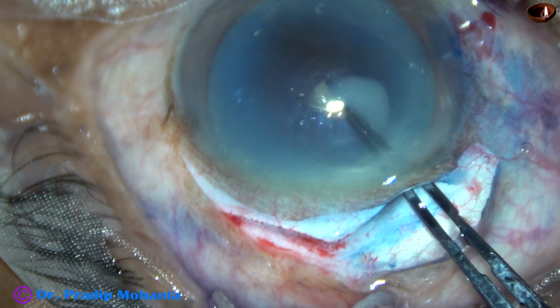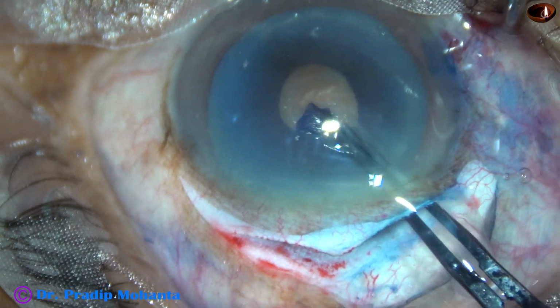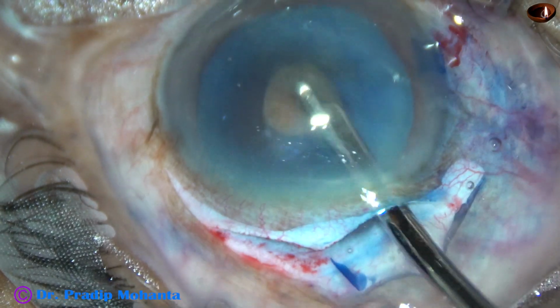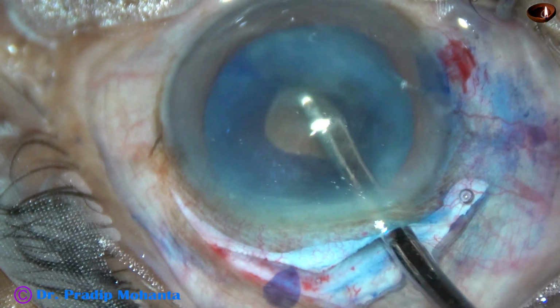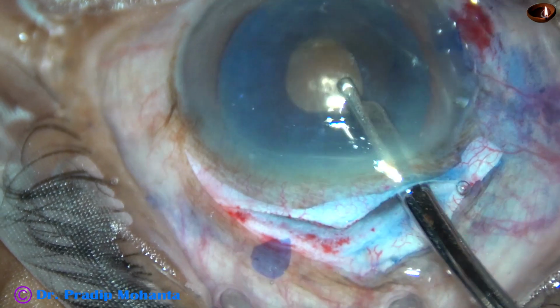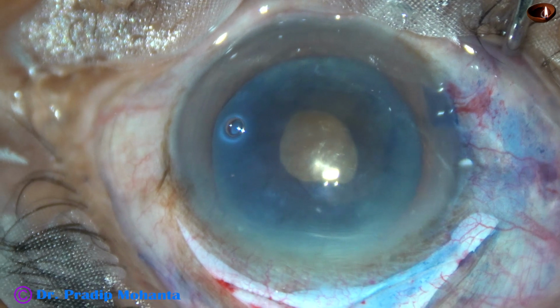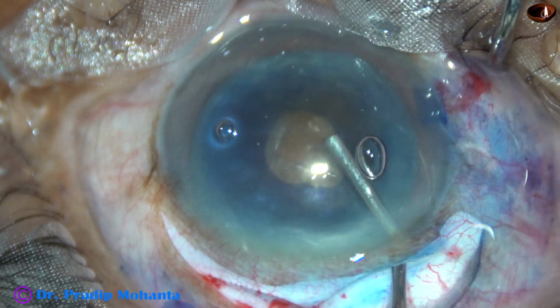I did a small rhexis first in this case. If milky fluid comes out, we need not do a small rhexis. We can aspirate the milky fluid through that incision, but I just did it. We can apply some pressure over the rhexis margin if it is a mini rhexis. If it is not a mini rhexis, just an opening, just an incision, we have to do it gently. And now again the anterior chamber is filled up with 2% hydroxypropyl methyl cellulose.